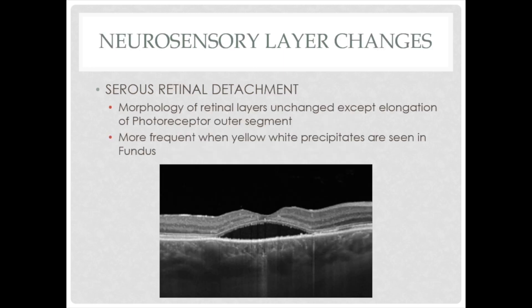Changes in the neurosensory layer: serous retinal detachment is one of the pathognomonic characteristics seen in acute CSCR. The morphology of the retinal layers remains unchanged except for elongation of the photoreceptor outer segment. In acute cases there is minimal elongation, whereas in chronic cases the photoreceptors remain detached from the RPE for a longer period, resulting in inadequate phagocytosis and elongation of the outer segment — sometimes called shaggy photoreceptors. A persistent thick outer segment may progress to a permanent subretinal deposit with very poor visual prognosis.